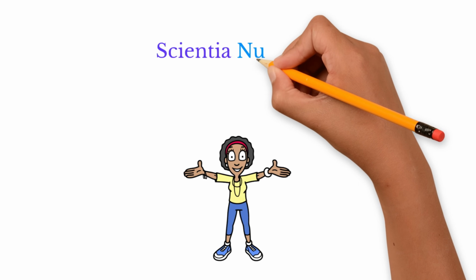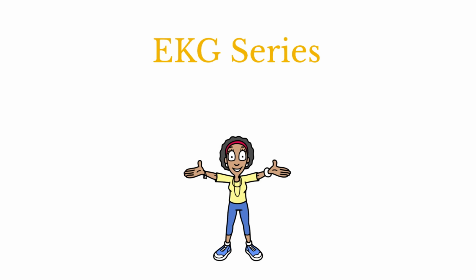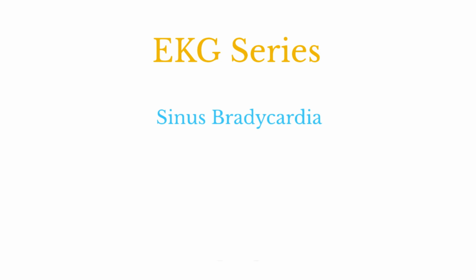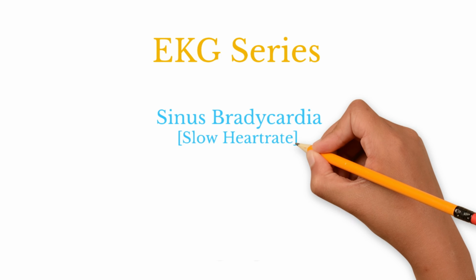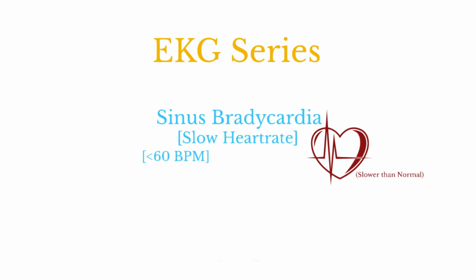Welcome to Scientia Nursing. We will continue our EKG rhythm series today, and we're going to talk about sinus bradycardia. It is the opposite of sinus tachycardia, and it means a slow heart rate. Sinus bradycardia is a cardiac rhythm characterized by a slower than normal heart rate. It originates from the good old SA node. In adults, it is typically defined as a heart rate of less than 60 beats per minute.